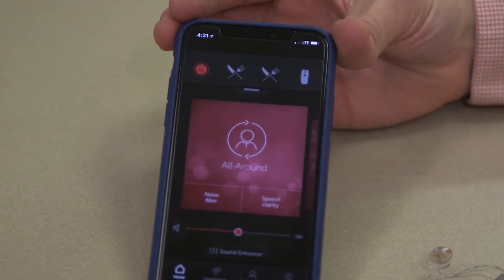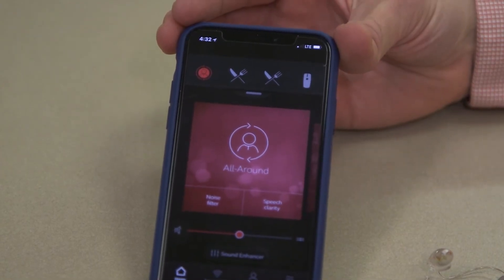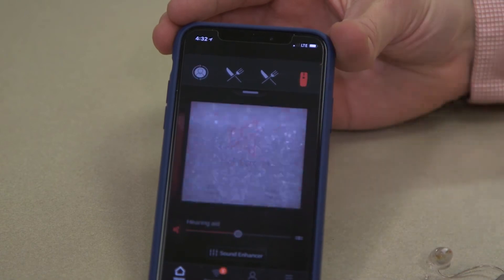Another way is to go into the app on the phone and select the emblem that's for the multi-mic. And a third way is to go into your Apple Watch and select the multi-mic emblem from that.